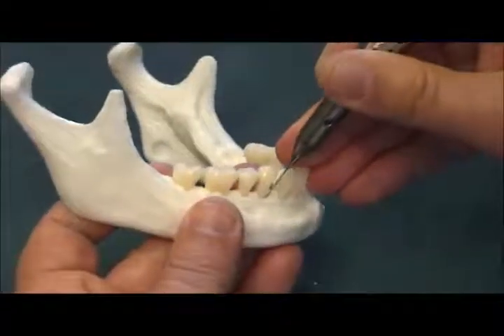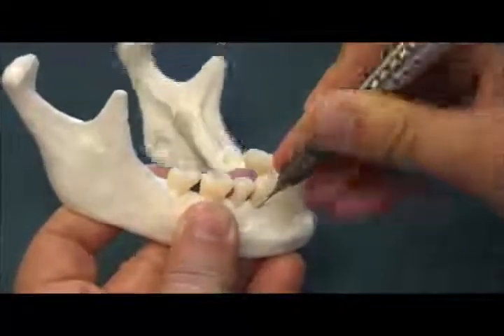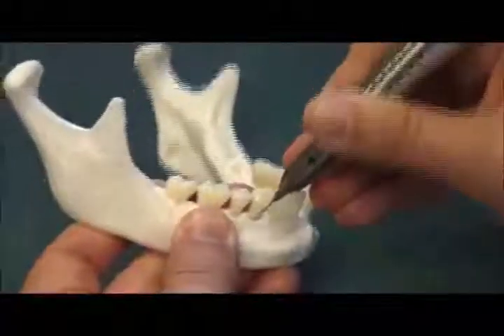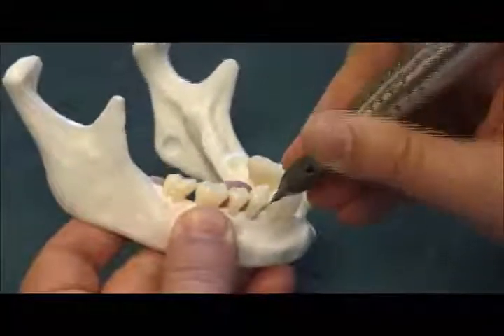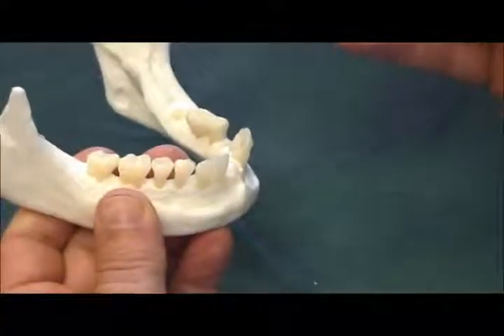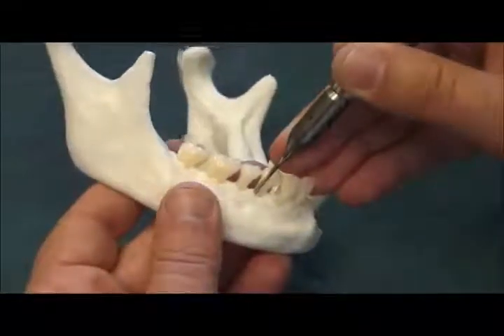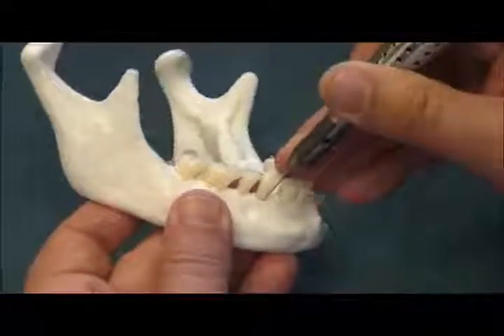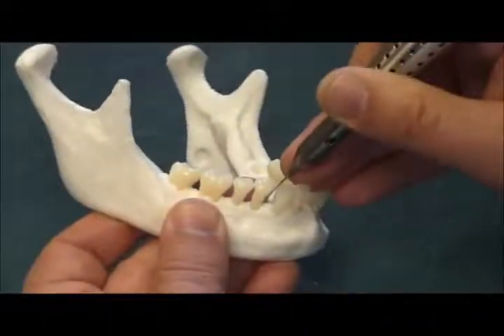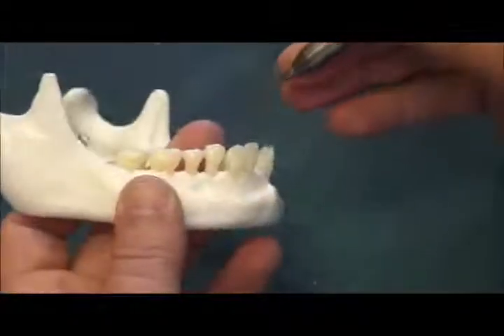Then I'd go over to the other side here, on the mesial facial, and just keep the tip moving. That's the important thing. Those sweeping motions are very important. And then wiggling it on the way out. Notice I'm not applying power as I'm removing it, because the powertome itself only applies force, pushing in, not pulling out. Now once the line angle areas have been freed up, I go into the interproximal more so, back and forth on the interproximal, just get that as freed up as possible. You can see how loose this is getting, and it's pretty true to life at what actually happens.